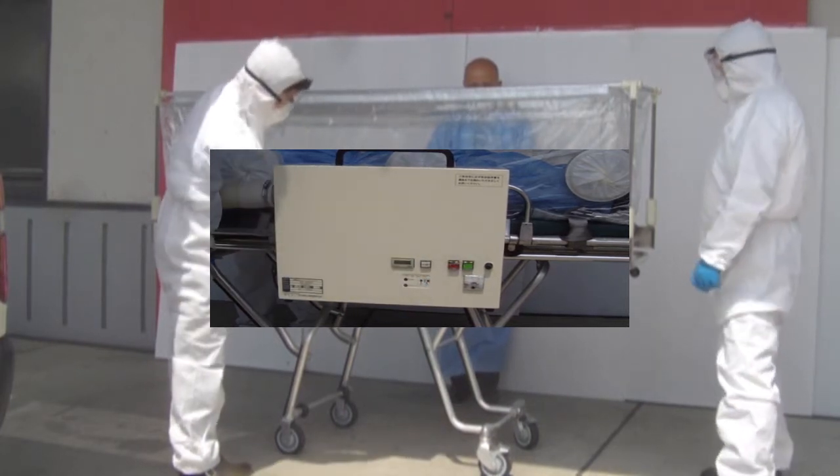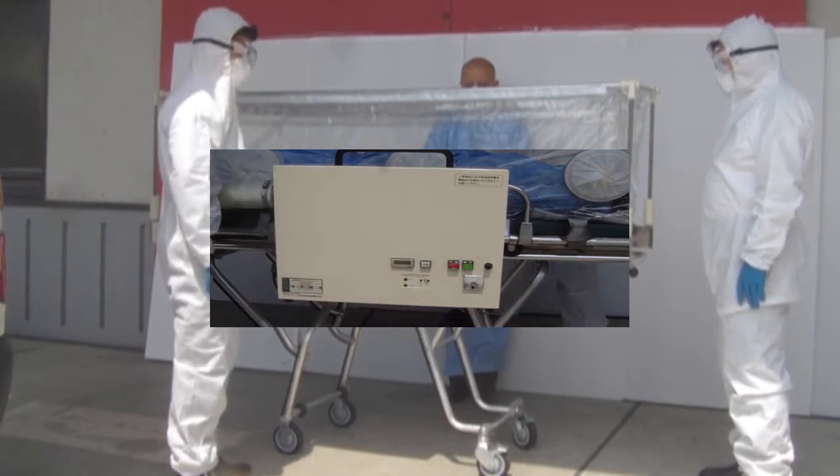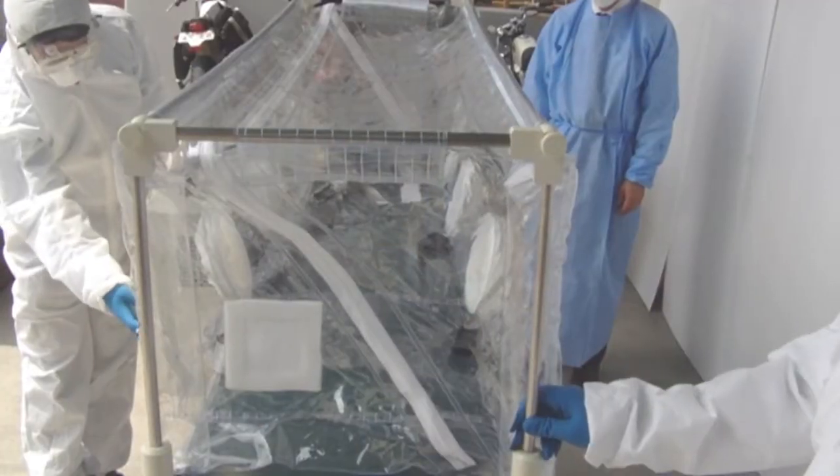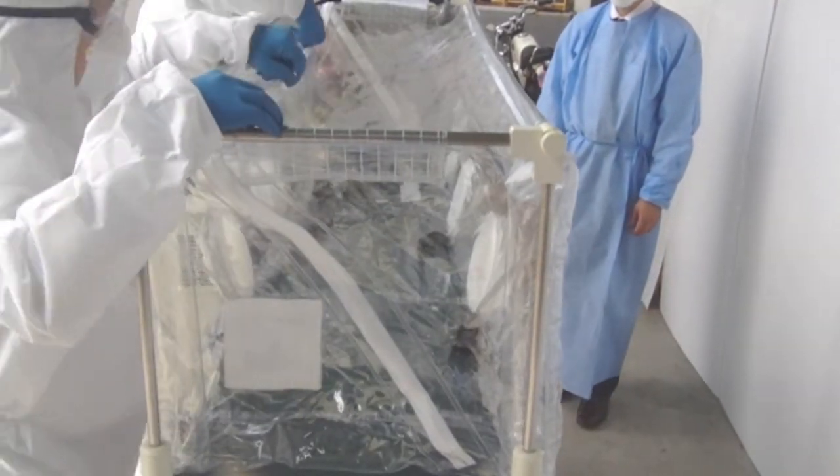Once the fan is in a steady state, the red air pump switch is turned on. The fastener is opened. The sidearm is knocked down. The binding capsule is opened fully.